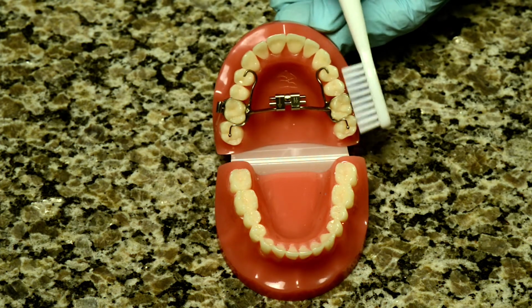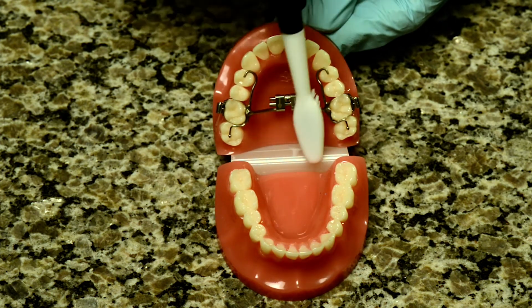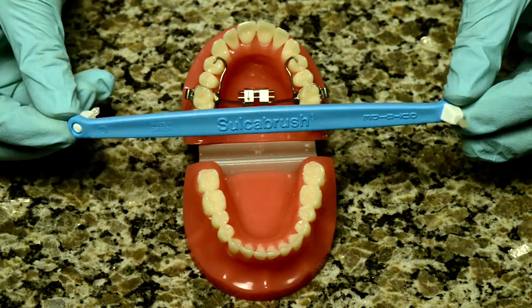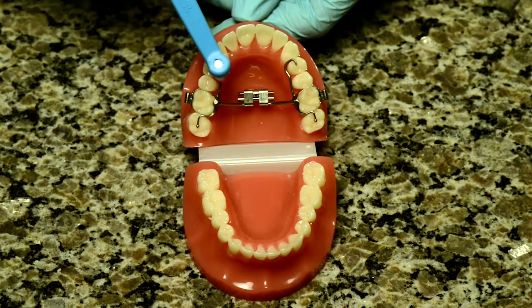If the RPE looks dull or fuzzy, then it is not clean. It should always look silver and shiny. You may need the help of a sulca brush to get along the roof of your mouth clean.